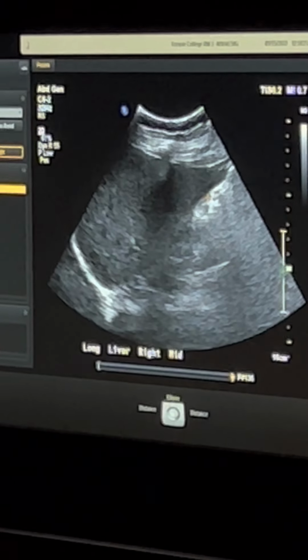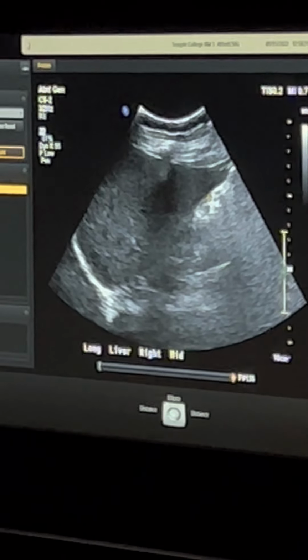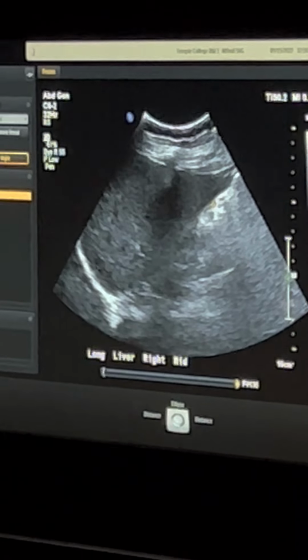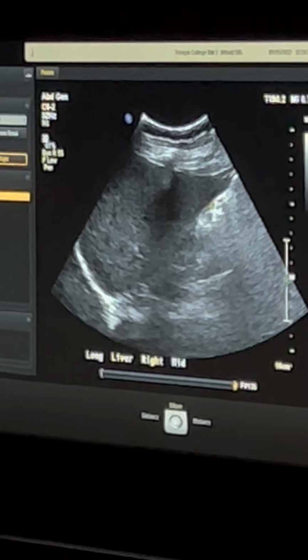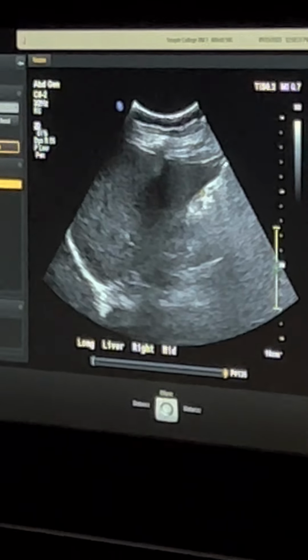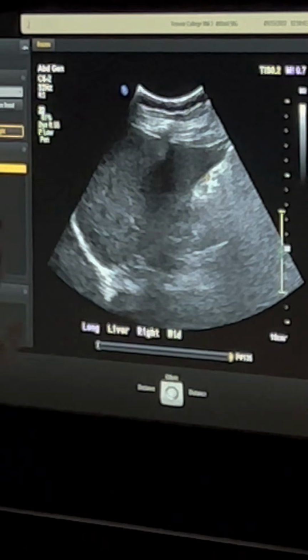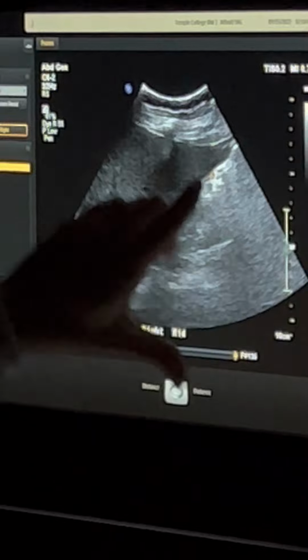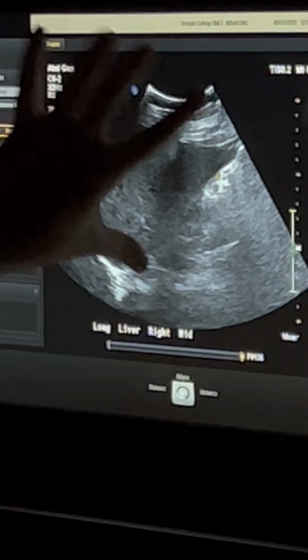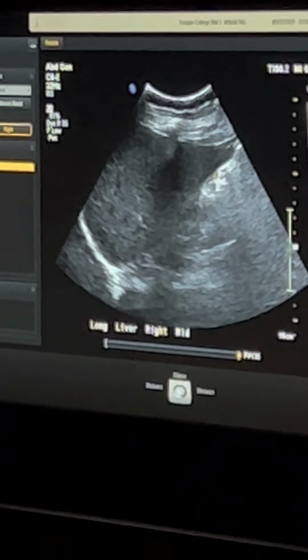Now, it is an AP measurement on the liver, even though it is called liver length, okay? Does that make sense for everybody? I always figure that confuses the crap out of some people to say it's the length of it, which if we're in long, it should be superior, inferior, but it is an AP measurement because that's the way that the organ is oriented in the body, okay?